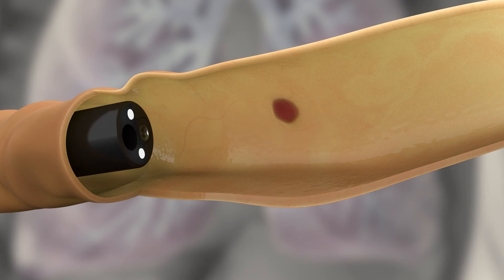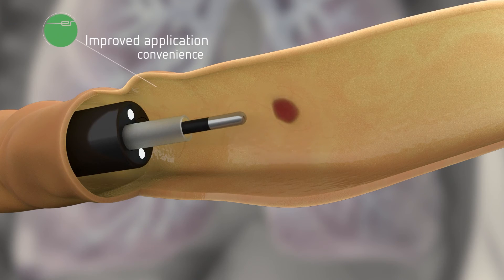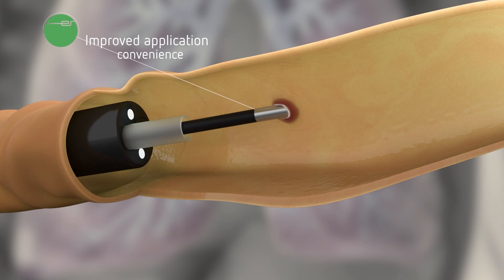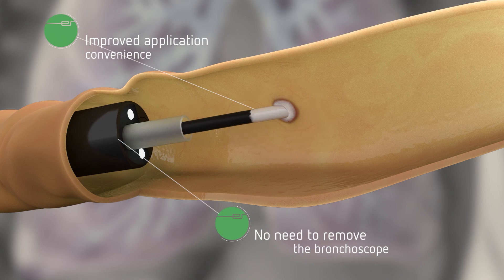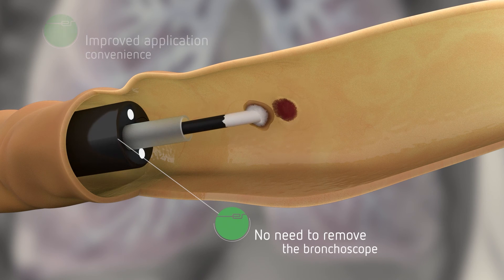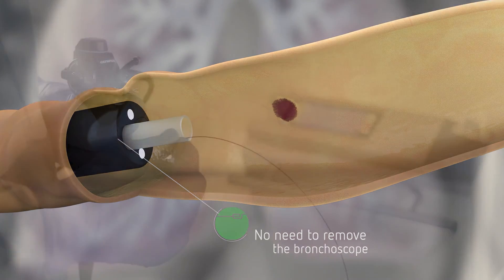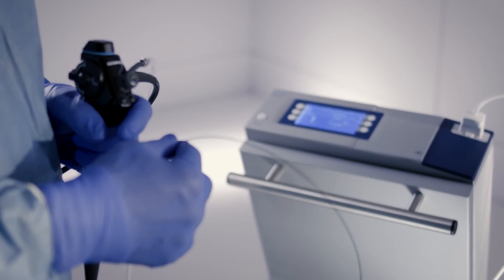With this combination, biopsies can now be extracted quickly and easily through the working channel of a bronchoscope. The bronchoscope does not have to be removed from the target area or the cryo-extraction.